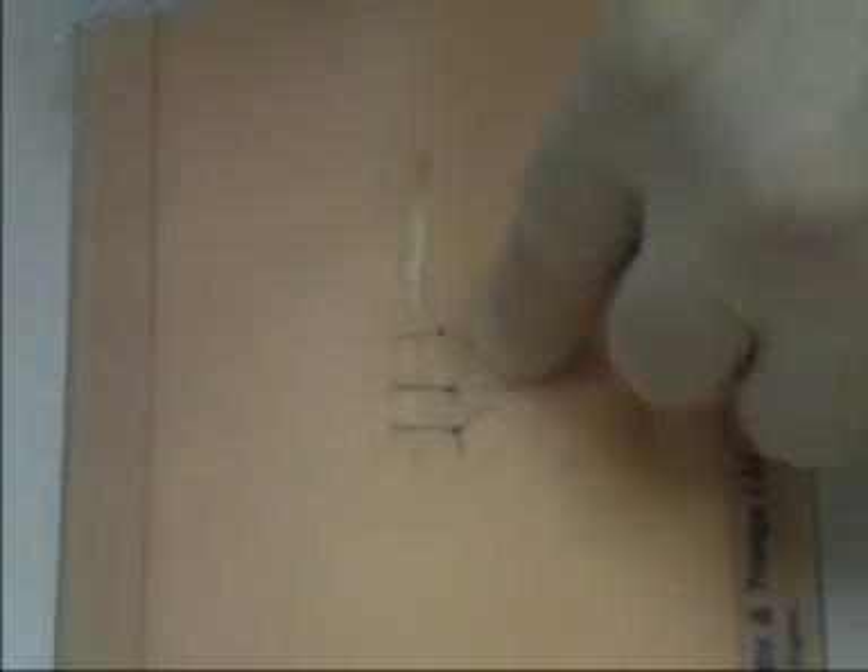Training surgeons initially tend to place their sutures too close to the skin edge and too superficially.